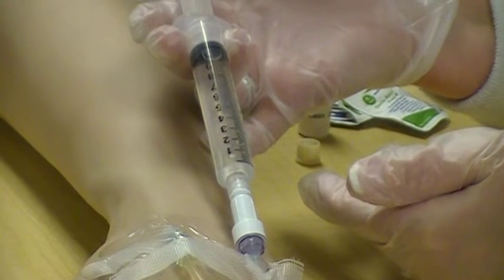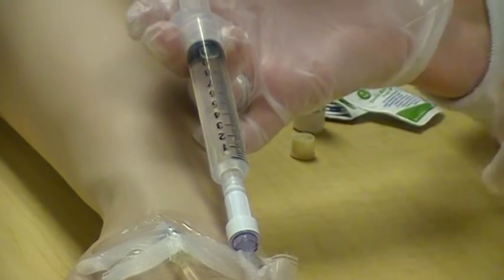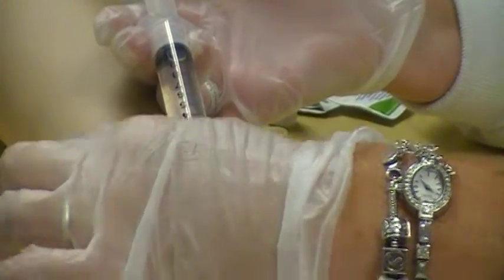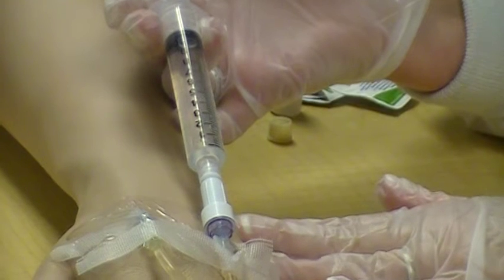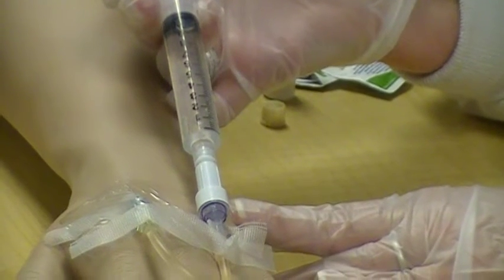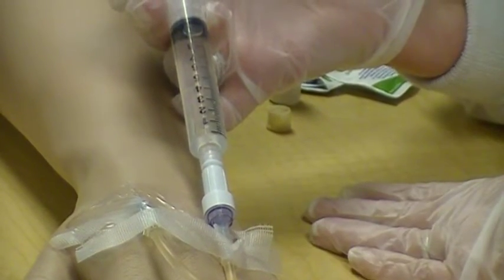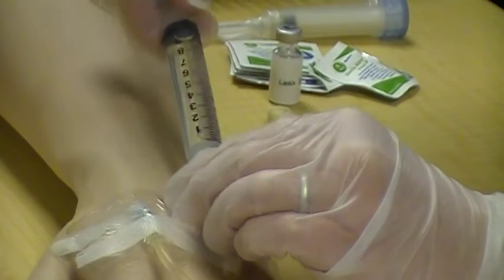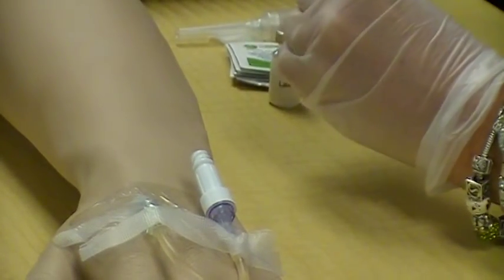In this instance, it's pushing very smoothly. I don't have to use a lot of force. I can also look at my site, and I don't see any swelling occurring while I'm pushing the medication. So again, I'm going to push 1 milliliter over 1 minute. For time purposes, we're going to say that it's been a minute. So next we're going to take it off, lay it down to the side, and put the cap back on it.